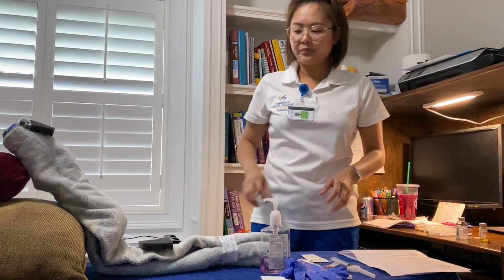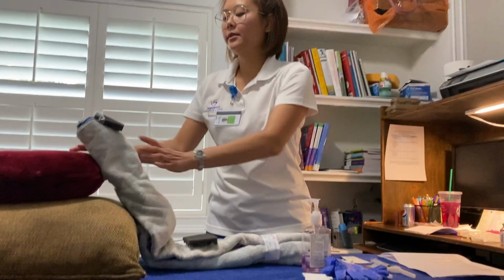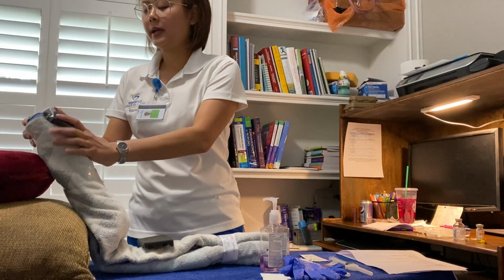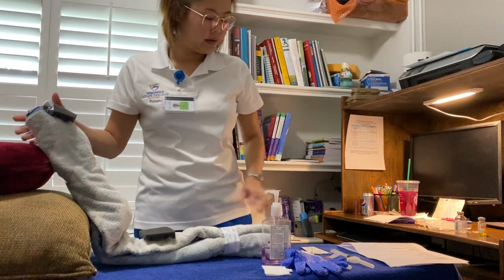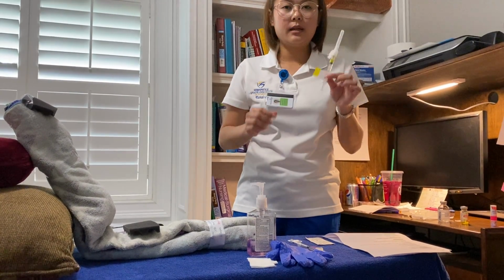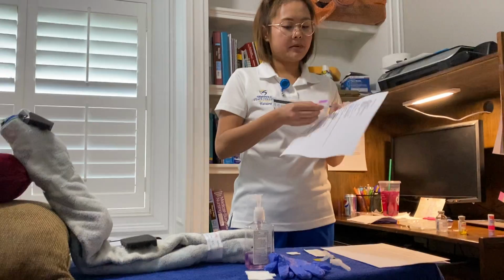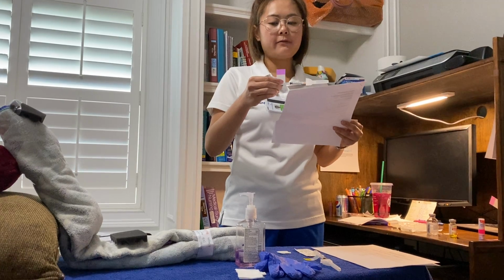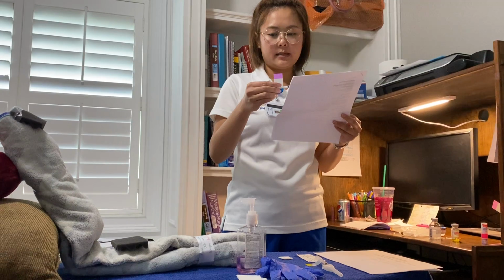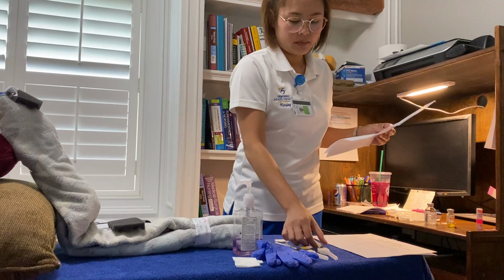So good. Okay. I'm going to position you to be ready for the injection. Do you want the right arm or the left arm? Right arm. Okay, so right arm right here. Just relax your arm. Okay. Now I'm going to do my third check. Here I have Anna Hawaski, B12 500 microgram sub-Q once a month, and the time is now, and documentation will be done after the medication has been given.